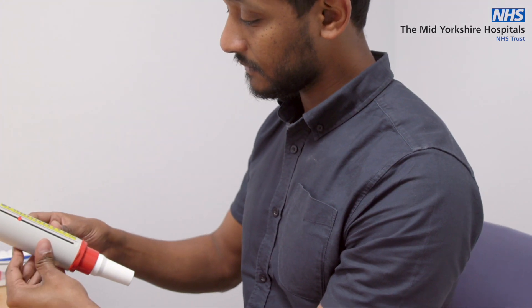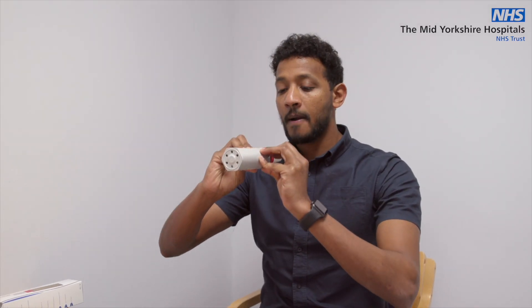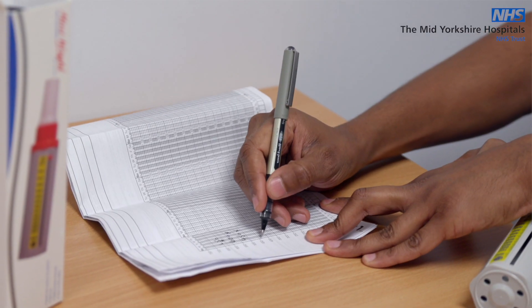It's as if you are blowing out a candle that is far away through the meter. Make a note of the number that is next to the arrow on the meter. Repeat this three times and record the best of the three — this is your peak flow score. Take your peak flow readings before any asthma medication.